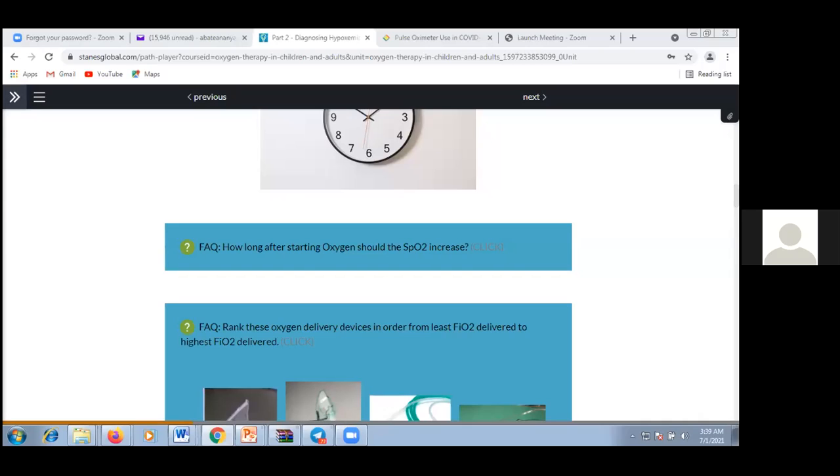The mechanism of detecting oxygen saturation is different for this group of SpO2 devices available. But looking through this literature and also from our experience, what we can say is it varies between individuals, as so many of you were saying, and it varies with the type of pulse ox you are using and the quality. But in general terms, there is a latency of around 30 seconds. Some may even say up to 45 seconds. So a 30 to 45 second latency is something expected.